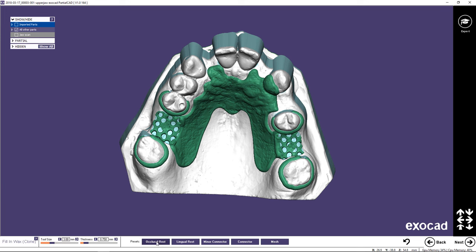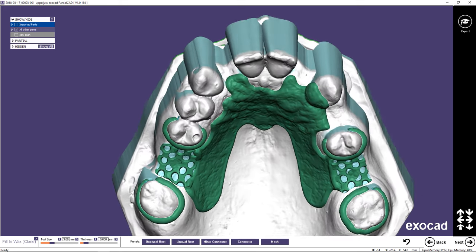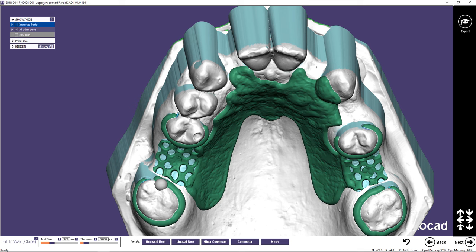Using the Clone tool adds a precise amount of wax to the surface of the refractory model. Each preset in the Wizard menu has its own default value and hotkey. Change your view so you are looking at the surface the measurement is to be based from. Wax all rests and minor connectors.